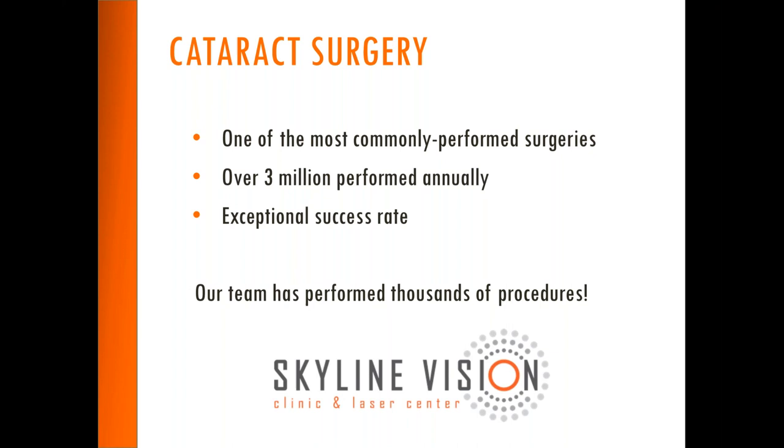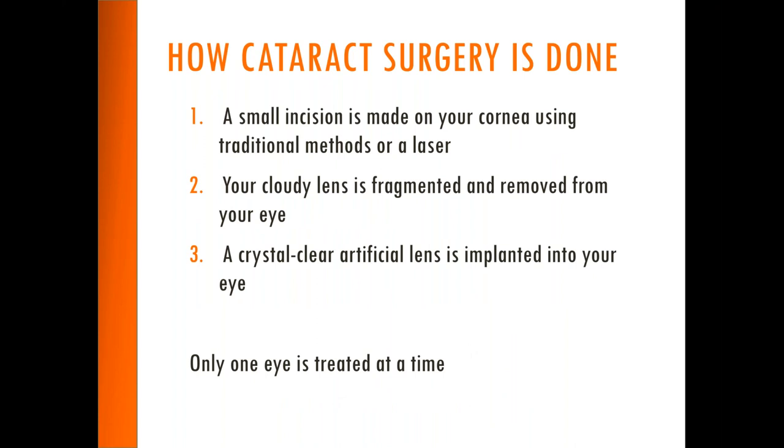I will talk about a typical cataract surgery. When we have surgery, we will perform it in an ambulatory surgery center. It's a same day surgery. You will arrive most often about an hour before your scheduled procedure time. During that time, there are some forms that are signed and filled. You are escorted into a bay where you have a dedicated eye surgery bed for you.